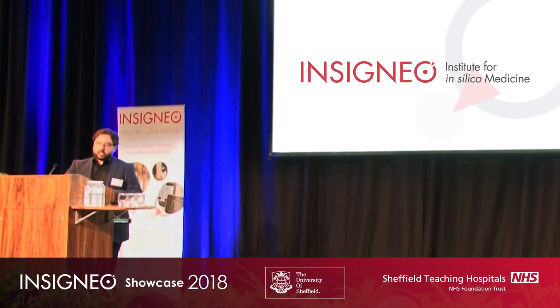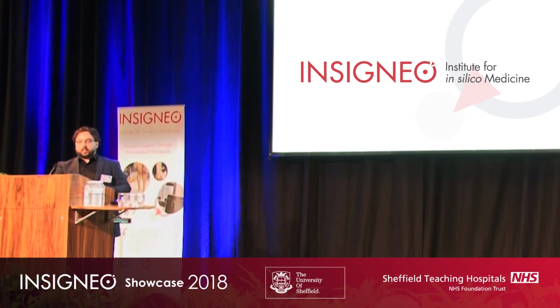In terms of a first application, I would like to show you a collaboration that we did with Flinders University in Adelaide in Australia. Dr. Martelli and Dr. Perilli collected a beautiful cohort of images of the proximal femur that were scanned at high resolution with synchrotron at 30 microns, and they did a stepwise loading test where we acquired 6 images from the undeformed configuration until after failure, as you can see on the left-hand side.